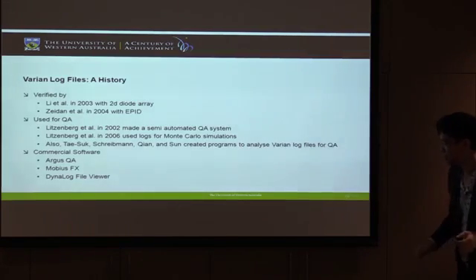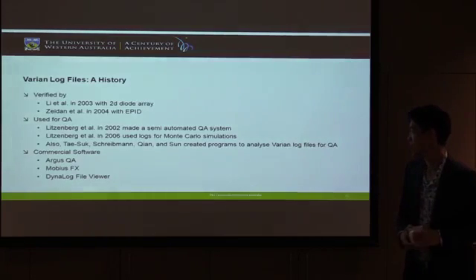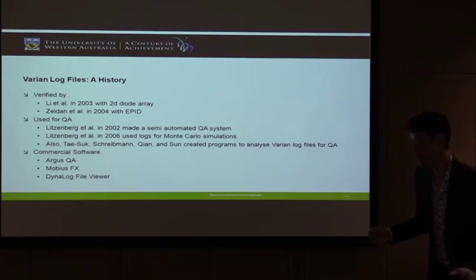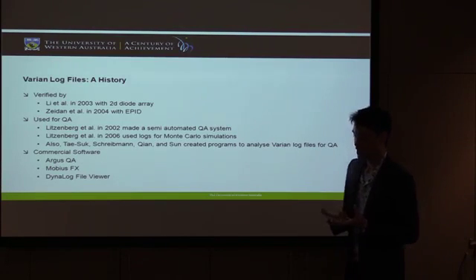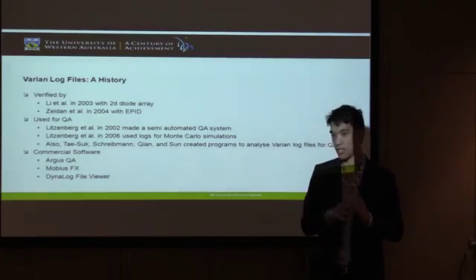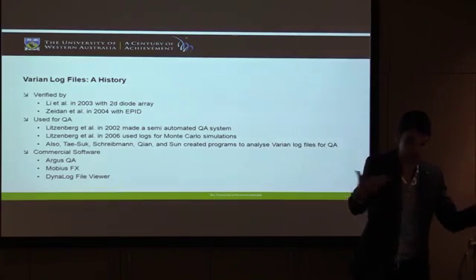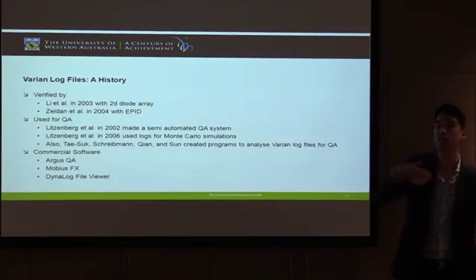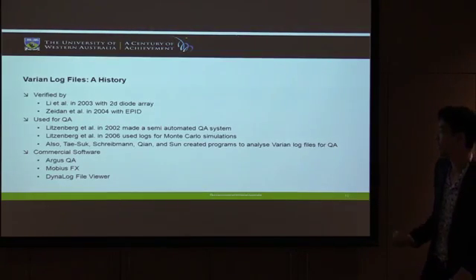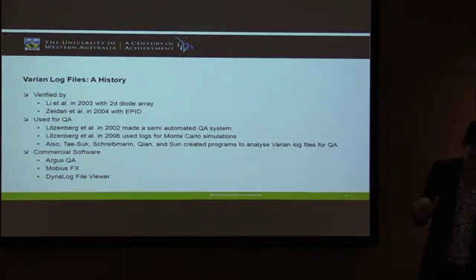And also, these other people, whose names I will not try to pronounce, also created many programs to analyze Varian log files for quality assurance. Some of the interesting ones take the actual positions of the leaves after the treatment and convert them back to a DICOM file, then put it back into the treatment planning system. They run the treatment planning system again, so you can find a dose volume histogram and all this really cool information. I didn't get a chance to do that, unfortunately, but it is there and it has been done.